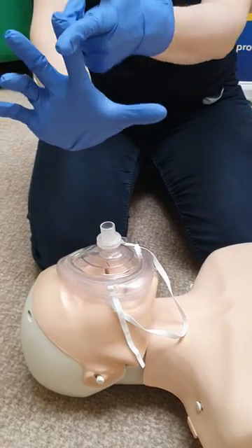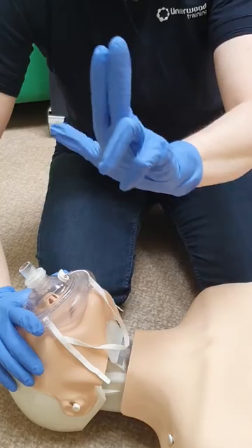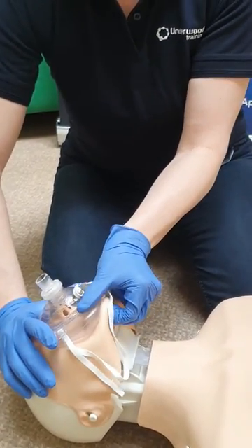I'm going to use the finger and thumb of my hand at the top of the head end on the cuff to get my head tilt. I'm going to use a couple of fingers underneath the chin to lift up, and clamp the mask down.